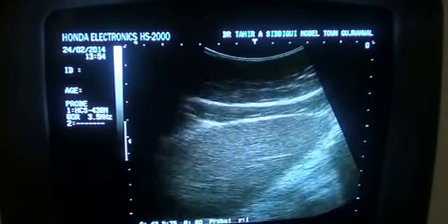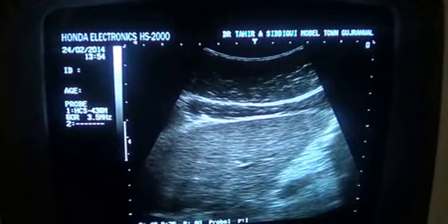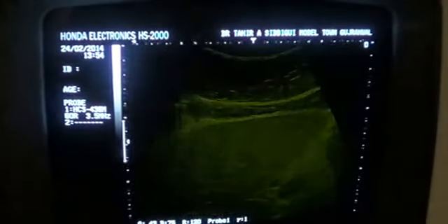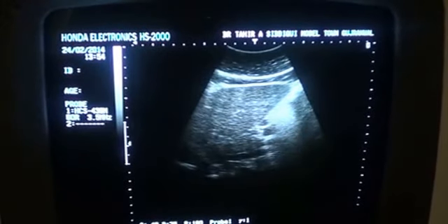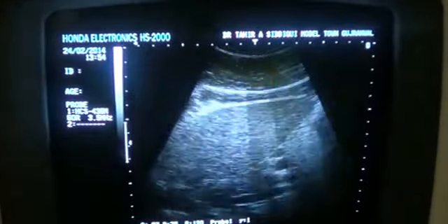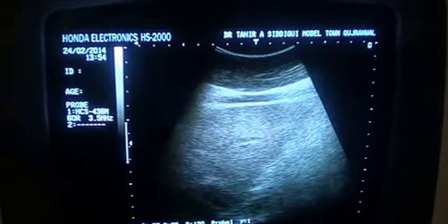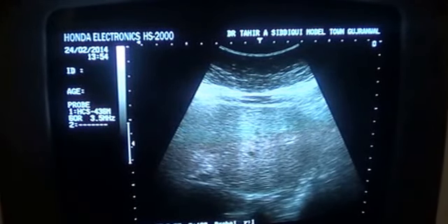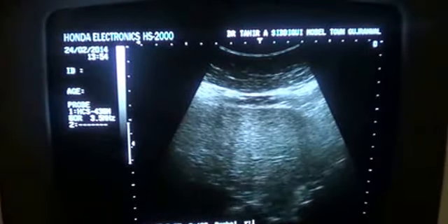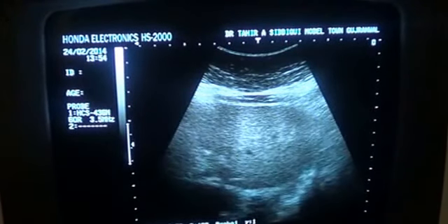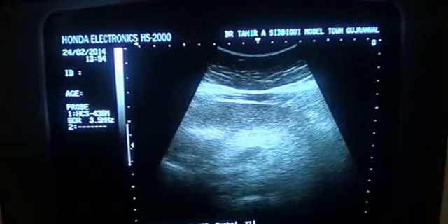This is the liver, which shows chronic liver parenchymal changes. The outer surface is still smooth — not as irregular as we typically see in cirrhotic liver. So this represents an early stage of cirrhosis.